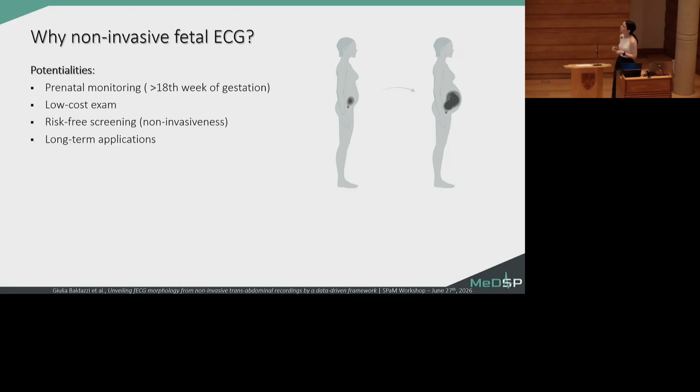And it can also be used in long-term applications, allowing for fetal arrhythmias detection or beat-to-beat variability analysis.